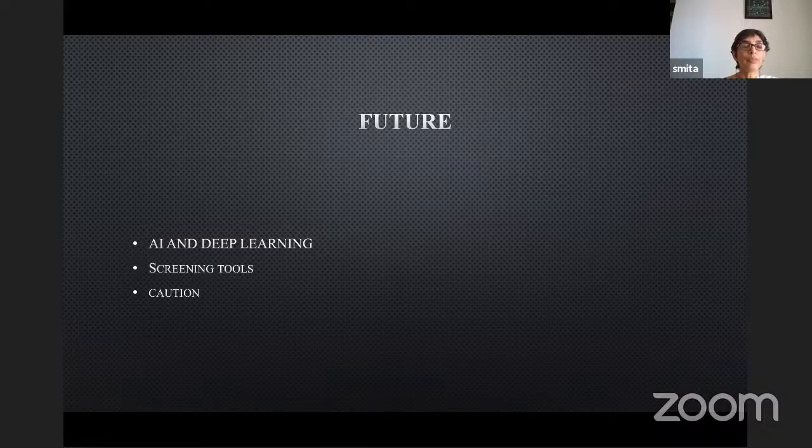And I want to point out that perimetry still has some problems. It has more test-retest variability, and there are lots of unsolved issues, including lesser sensitivity. So artificial intelligence and deep learning techniques, especially deep learning neural networks, can be used to identify glaucoma early. However, I want you to exercise caution, because this may create a lot of emotional or psychological problems, because a potentially normal person is potentially being given a blinding diagnosis. And also caution should be exercised, because too many people would be diagnosed with glaucoma, creating logistical problems.